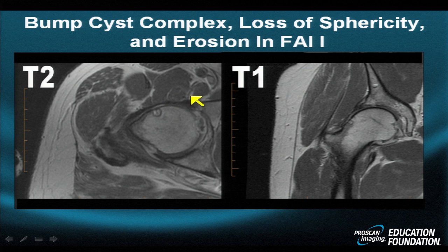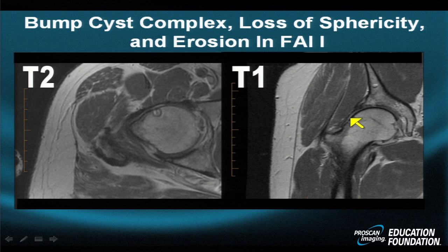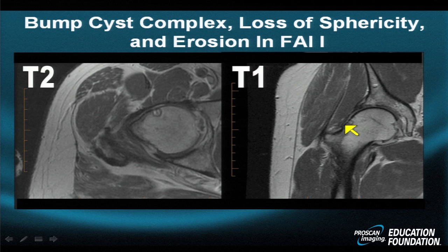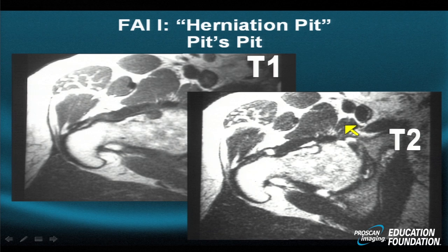The coronal projection demonstrates the loss of tapering of the neck. Here's a little bit of tapering; here's no tapering. When that tapering becomes very unexaggerated or convex outward, we sometimes refer to that as the pistol grip deformity. There's another example of a subtle bump-cyst complex.